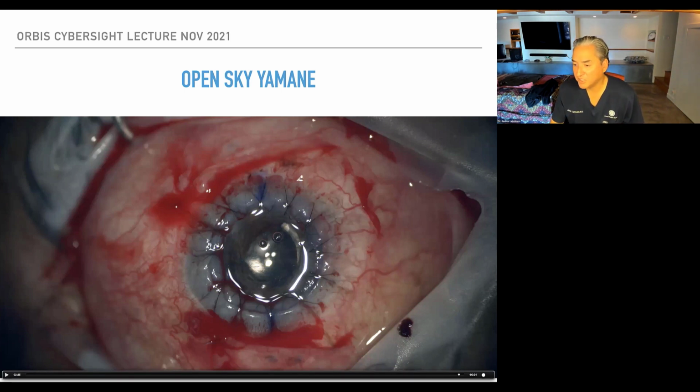So a couple of questions. Aisha asked, don't we need to irrigate and aspirate cortical material? So that's what I was kind of talking about. It's not as easy as it is during phaco. And so you don't necessarily have to.